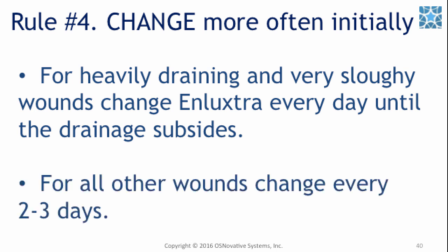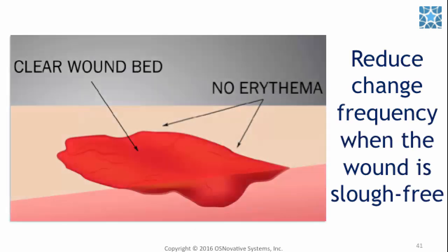For all other wounds, change every 2 to 3 days. You may reduce change frequency when the wound becomes slough-free. At this point, change frequency may be gradually reduced for up to 7 to 10 day wear time.